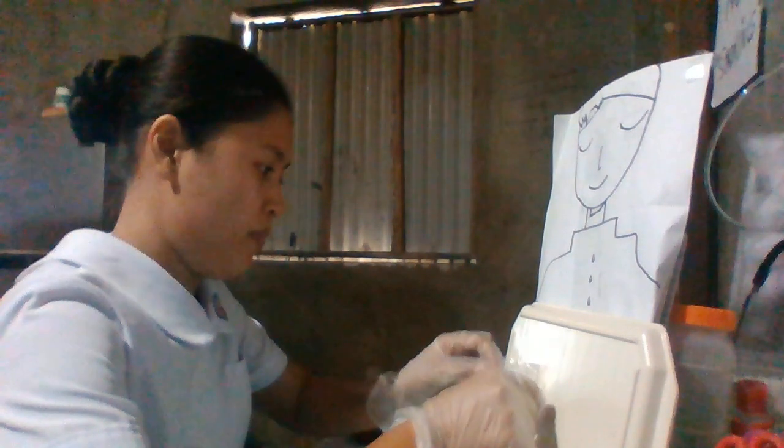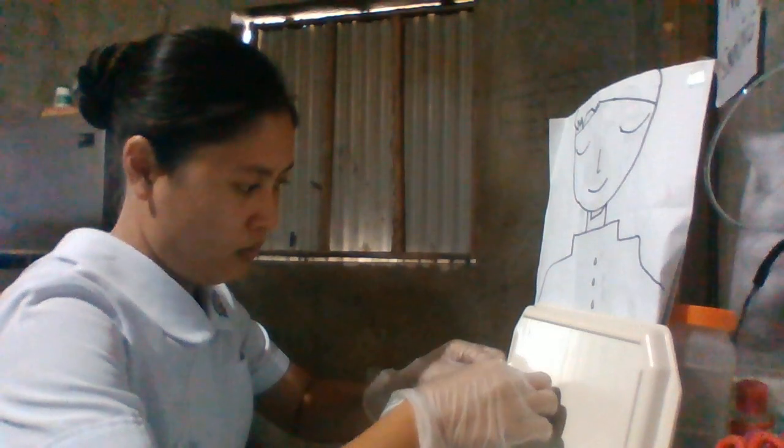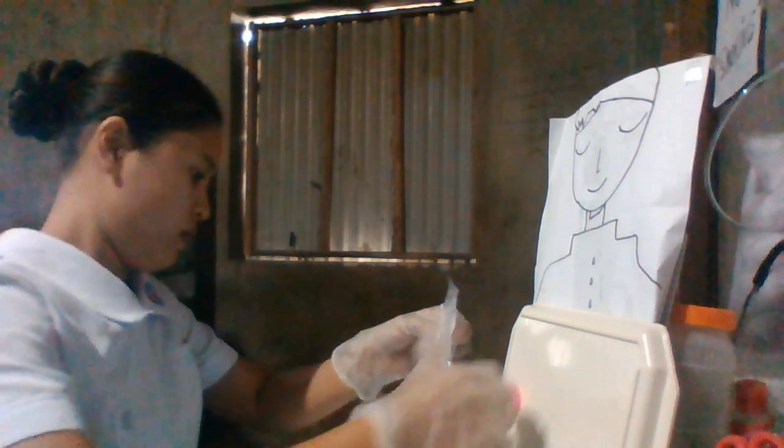Then afterwards, we can remove the old colostomy pouch and wipe with a washcloth. We can remove it slowly and gently.